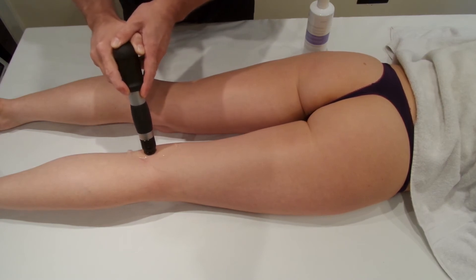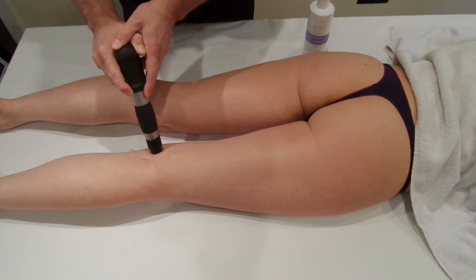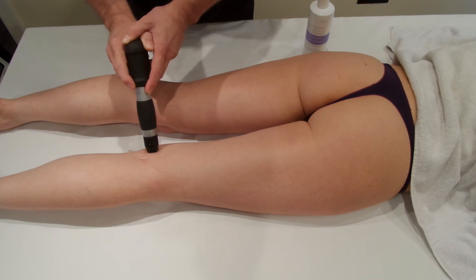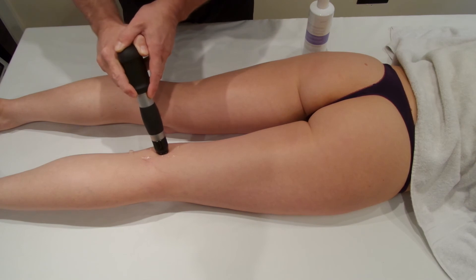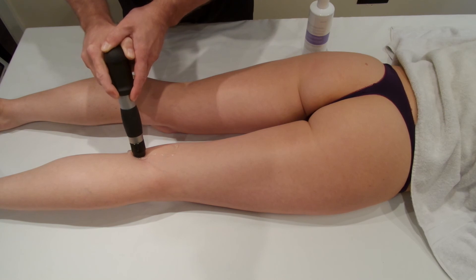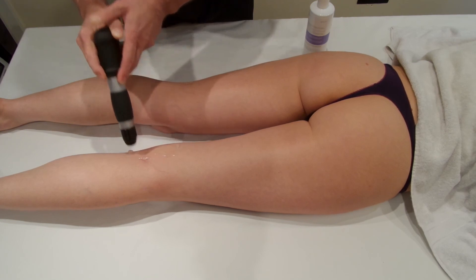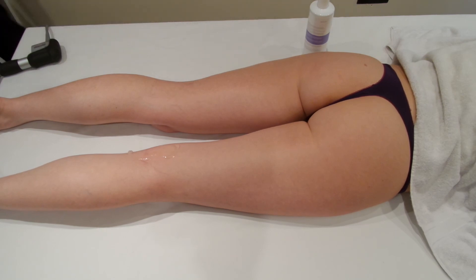You can see here we're just going up and down the tendons for 2,000 shocks, and that should increase the healing rate around the tendons. Okay, so that's it.